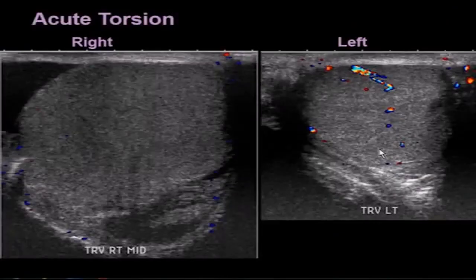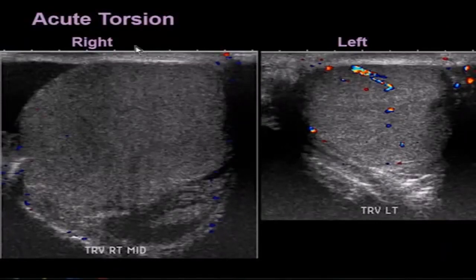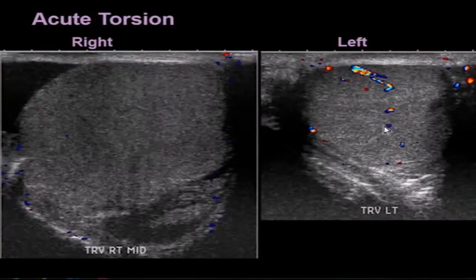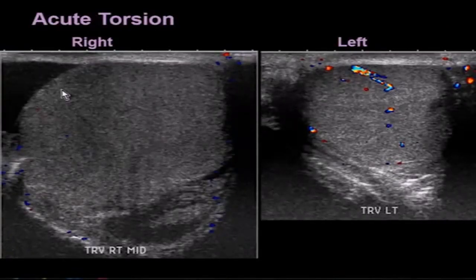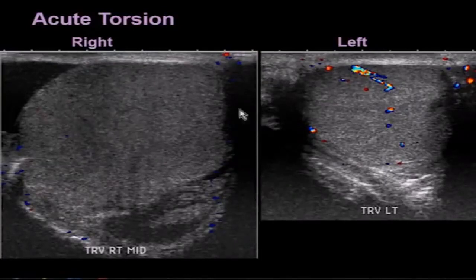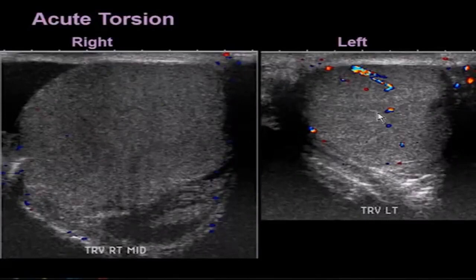Here's a patient with acute torsion. The left testicle is smaller than the right testicle — we can see blood flow inside the left testicle and no blood flow whatsoever in the right. The right testicle has homogeneous echotexture but is slightly darker than the left and increased in size.